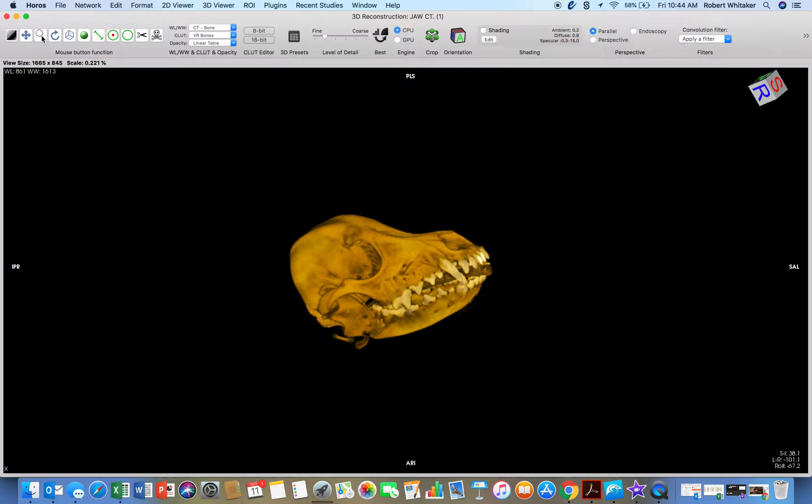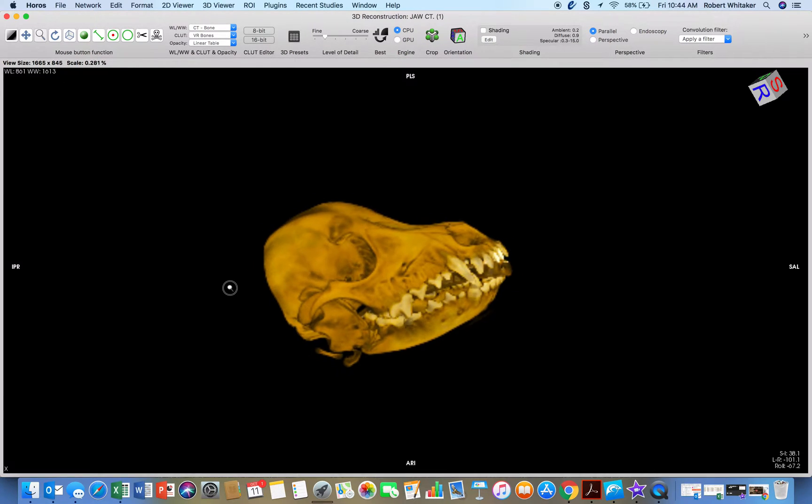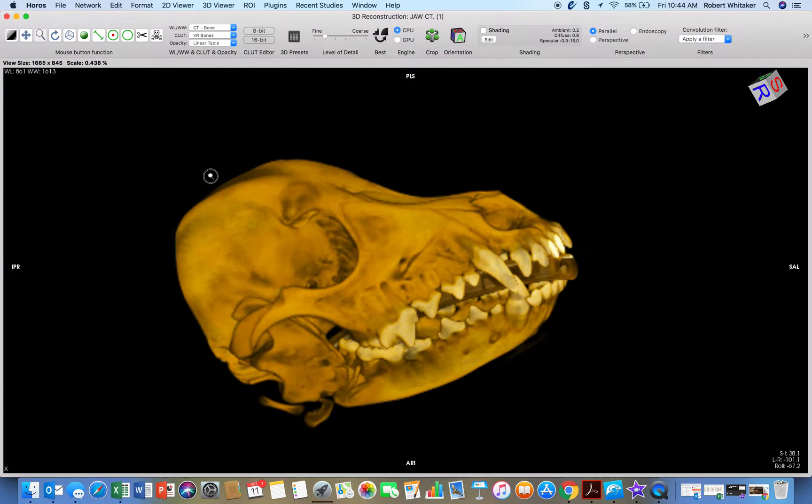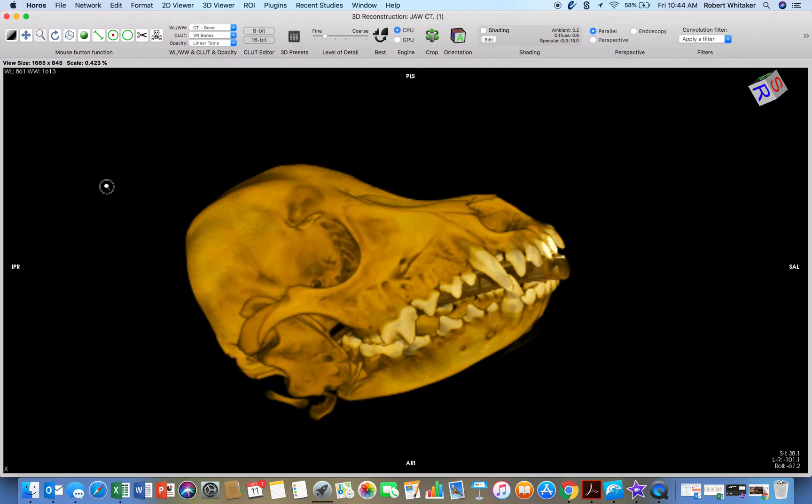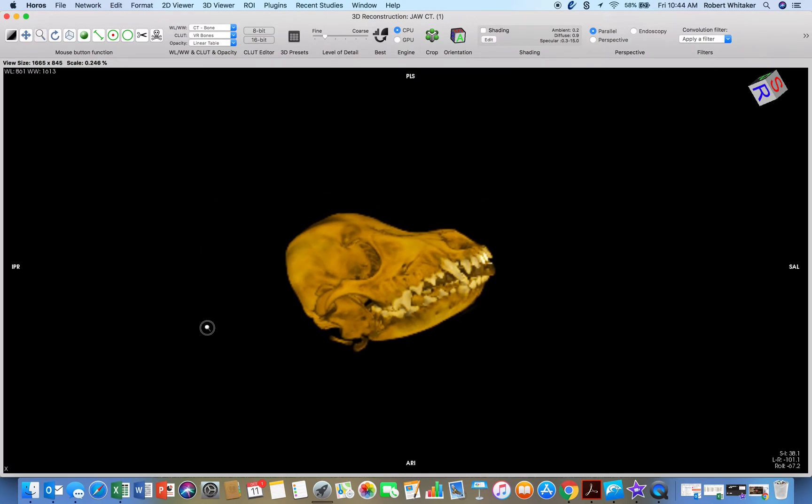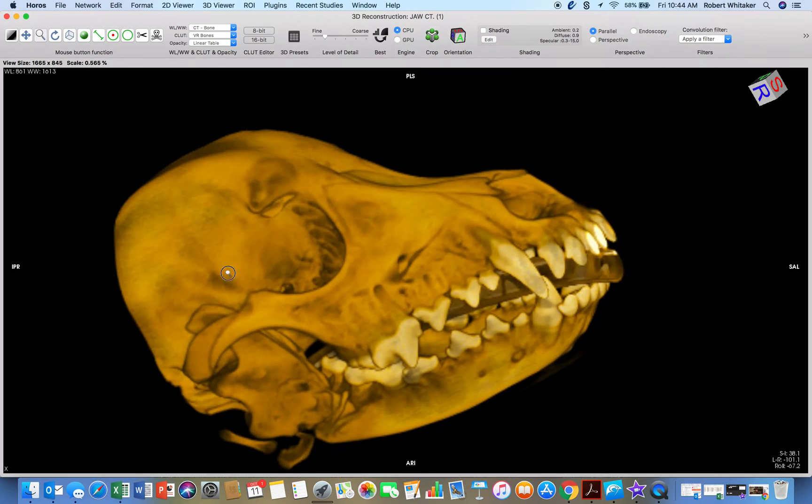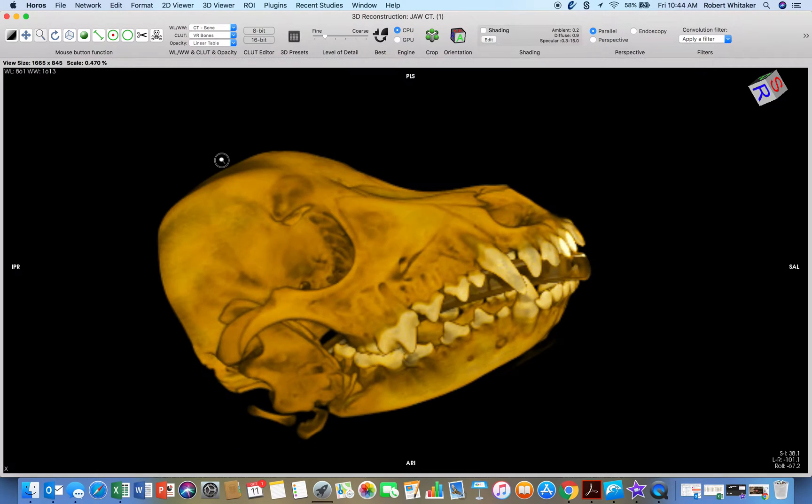I want to make it bigger. Use the magnifying glass here. Hold left click and then move up or down with your mouse.